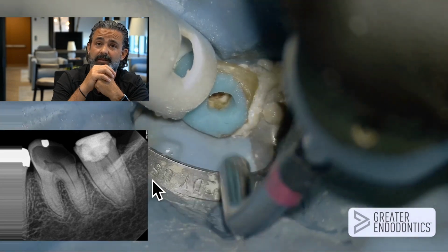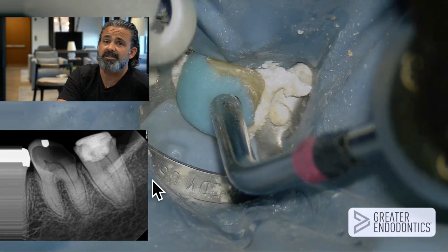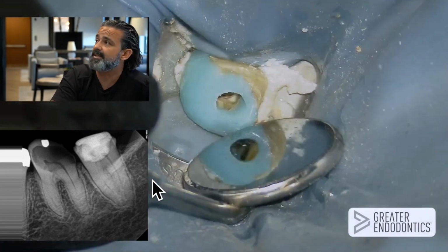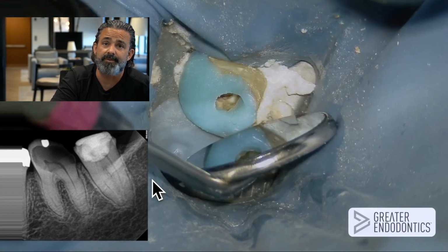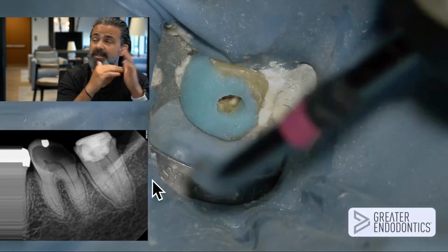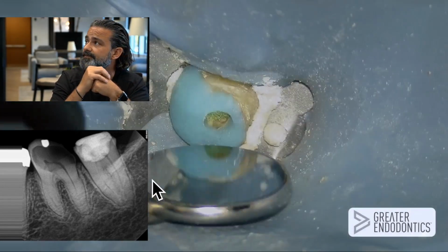I can keep picking and picking and picking, and that can add risk, add entropy. Life can happen along the way, and I can get heavy-handed. My assistant can hand me a crappy file. A lot of things can happen. Patient can sneeze, and I could break something because it's just going to hit. I'm hitting this wall the whole time. So I made the conscious decision to run the GentleWave.